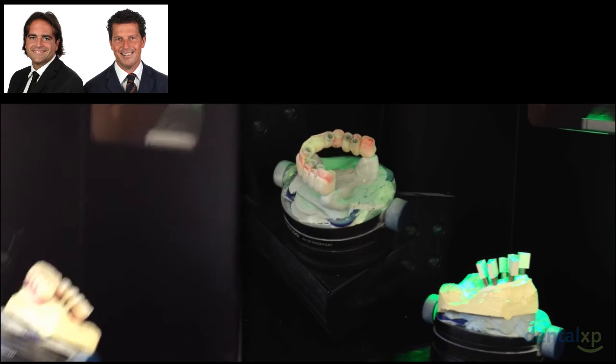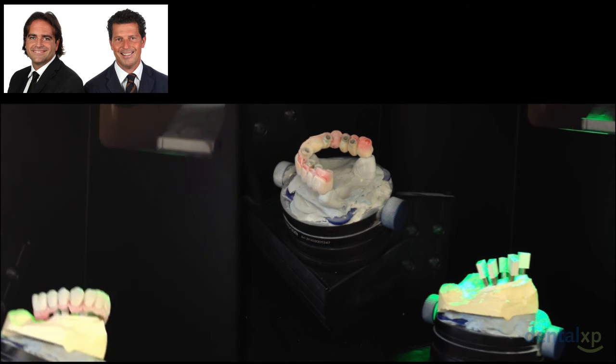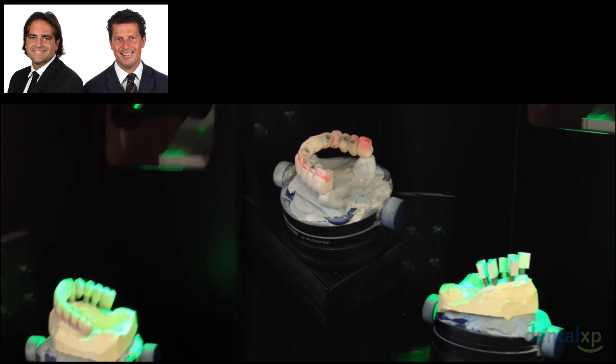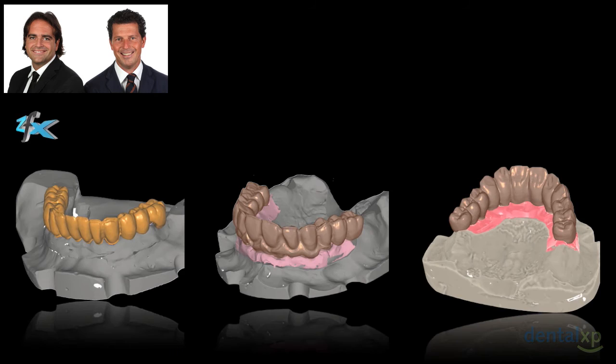You can see here, just to give you an example of how these new scanners are working, another restoration that we did with 6 implants with the scanner that is taking all the information. This information will then go to the software, will then go to the CAD, and Luca and Matteo can work on the final restoration. This is Sergio again, and you can see, as we said at the beginning, posterior monolithic zirconia, while in the anterior area it is reducing and giving some space for the veneering ceramic.